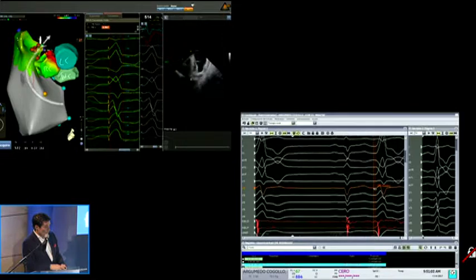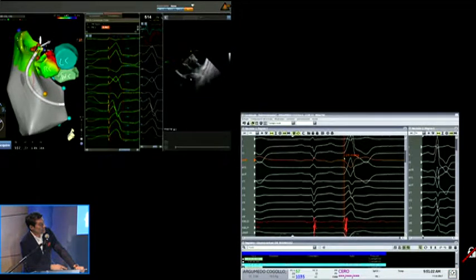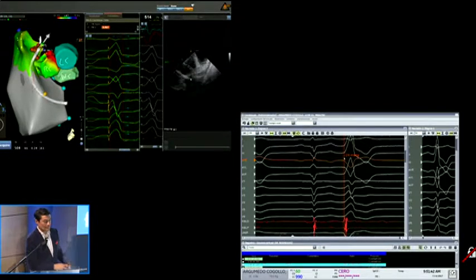Well, taking the initial electrogram, for me, AVL was more negative than the AVR. Although in D1 I see that it is more negative. And although the transition is in V3, I would go to the left cusp. Here we have the image for this site. There is some earliness. It is not the best earliness. We have the feeling with Andrea that perhaps it's in the left side where we have the greatest earliness.